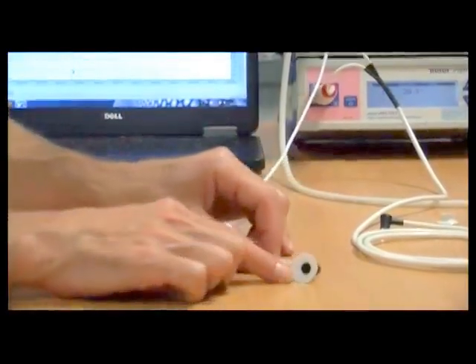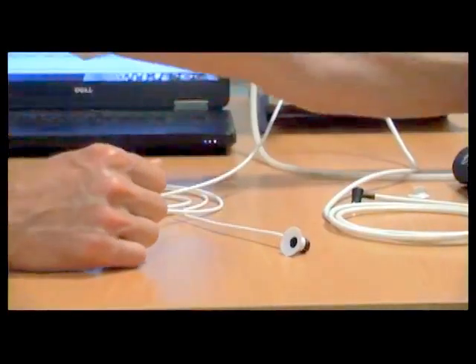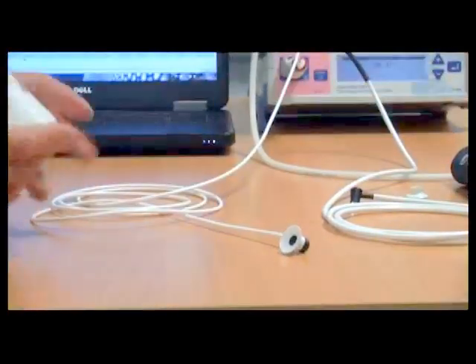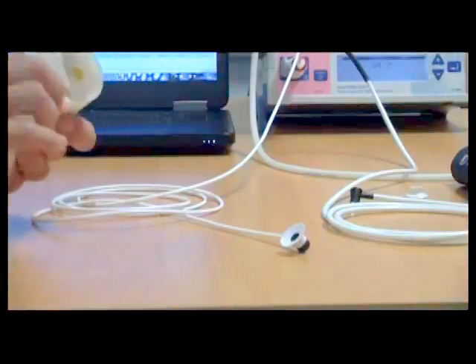And we'll attach the probe head and the probe holder onto the fingertip of our willing volunteer here.